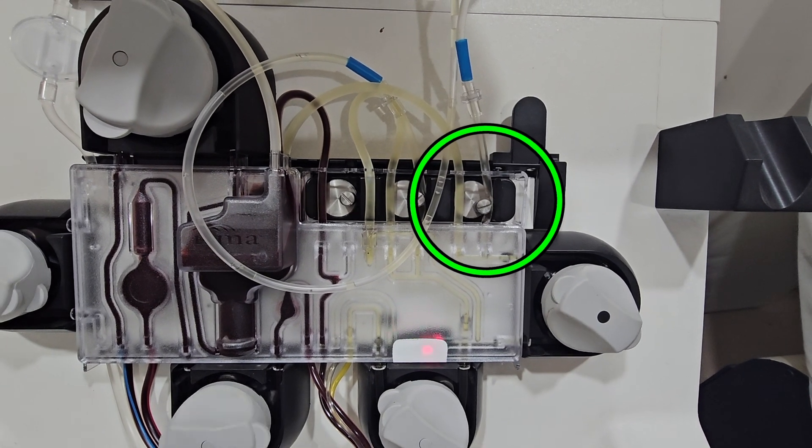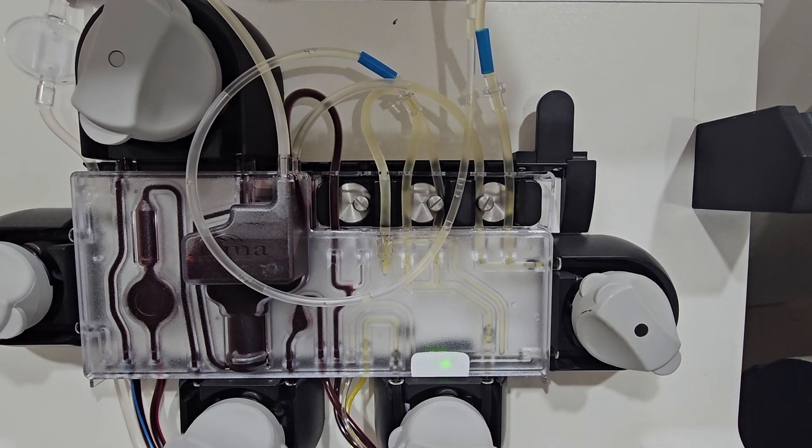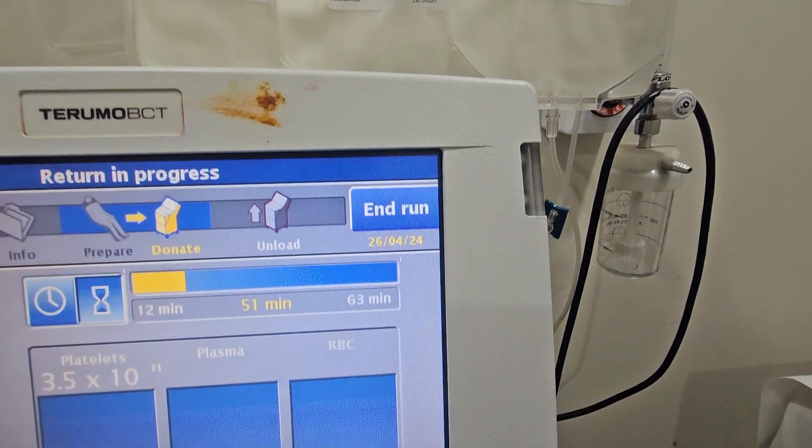Shifting of the knob indicates the beginning of component separation, thus initiating platelet collection.